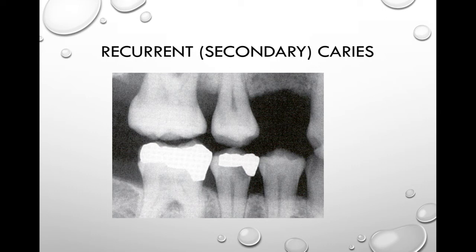Another way to classify caries is as recurrent or secondary caries. This occurs adjacent to or under an existing restoration. Caries lesions on the proximal and occlusal margins of restorations are easier to identify with radiographs because the x-ray can see underneath those restorations. They appear as a radiolucent area just beneath the margins. Here on tooth number 29, I can see recurrent caries — there is an MO amalgam with a radiolucent area underneath it.